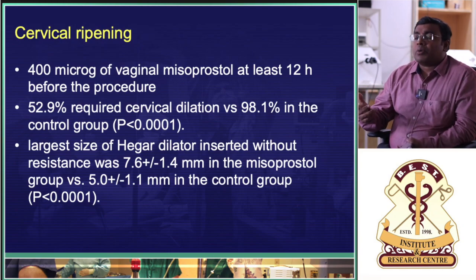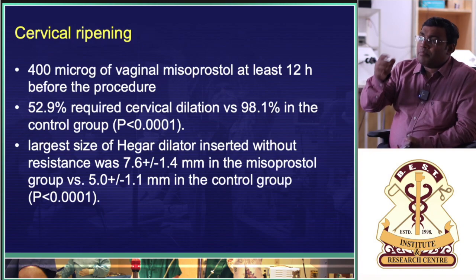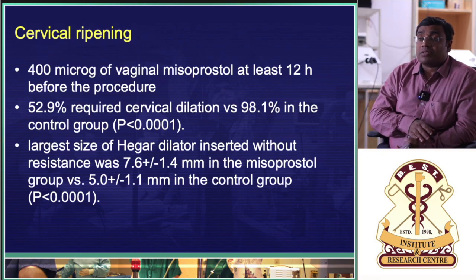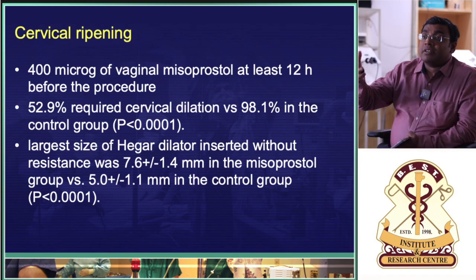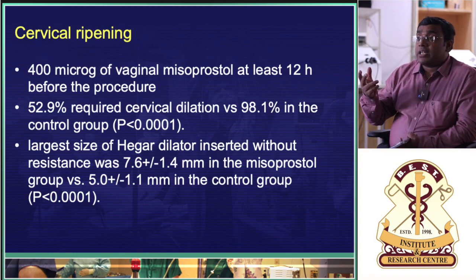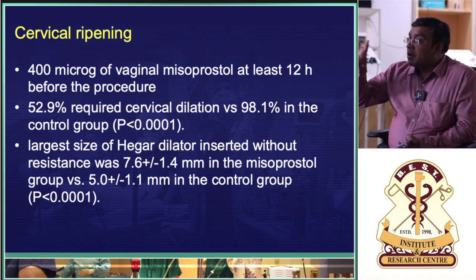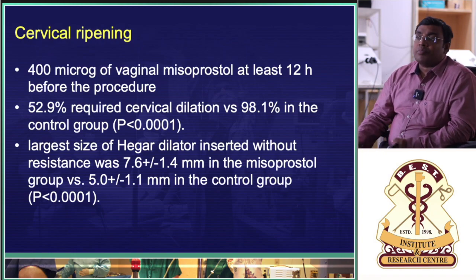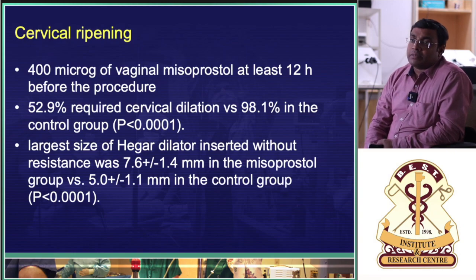In a laparoscopic procedure at the max, what happens? A vessel injury, bleeding happens, you give a blood transfusion. Bowel injury happens, you suture the bowel. Bladder injury happens, all those things. Whereas with hysteroscopy, when the cardiovascular system is affected and the normal physiological electrolyte balance is affected, the chance of morbidity progressing to mortality is very high. So never take hysteroscopy lightly, never ever, because you will end up in problems.